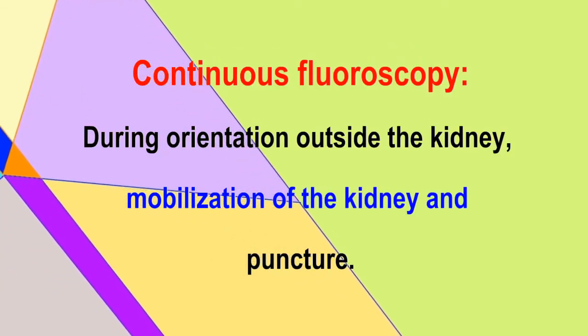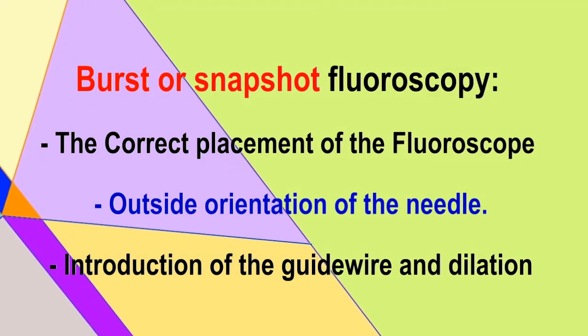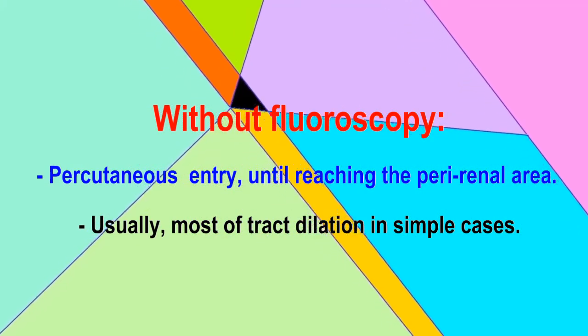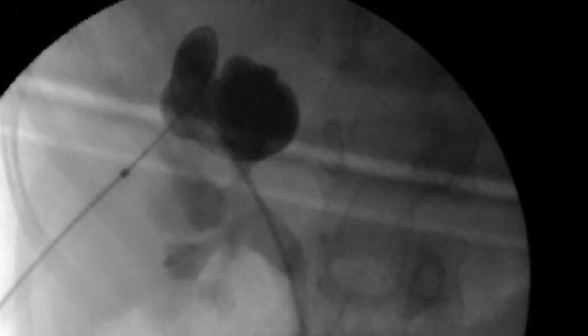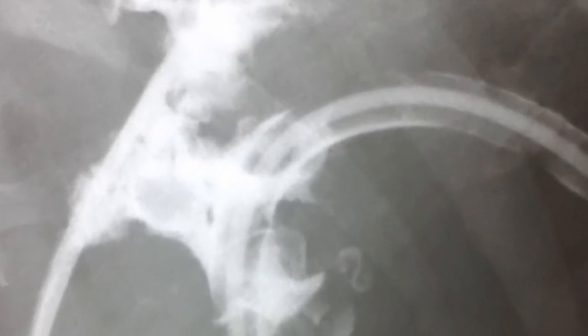Continuous fluoroscopy is performed during blind searching for the kidney, mobilization, and puncture of the parenchyma and calyx. Most of the other steps are performed with economic snapshot fluoroscopy. To gain time and reduce radiation exposure, even if the guide wire is coiled only in the pelvis or calyx, dilation of the tract is performed without further maneuvers to advance the guide wire down the ureter. Post-operative nephrostography gives feedback and confirms that the puncture was through the fornix and calyx.